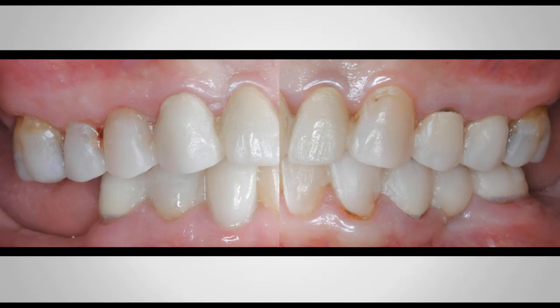My incisal ledge position is correct. She's happy with the phonetics. She's happy with the aesthetics. Now I'm going to go ahead and do the rest of the occlusion. And you can see here, I do my prototypes on top of these crowns, on the occlusal surface of these mandibular crowns. Same thing down here on this 3-unit bridge that she had here. And then I do these porcelain crowns that she's got here, on a natural tooth back here, and this natural tooth here and natural tooth here.